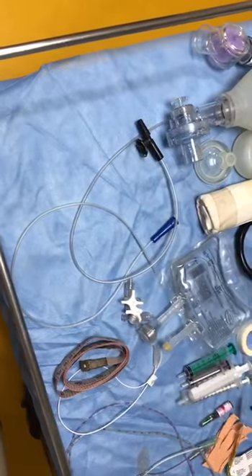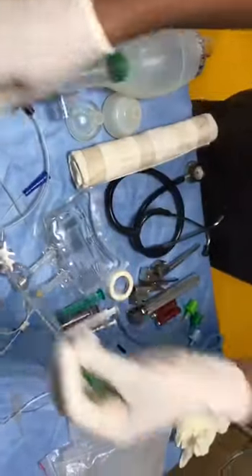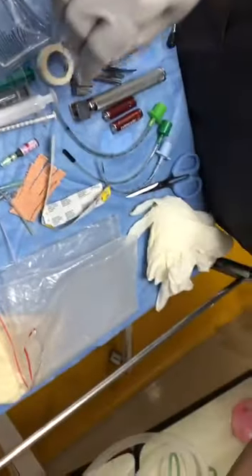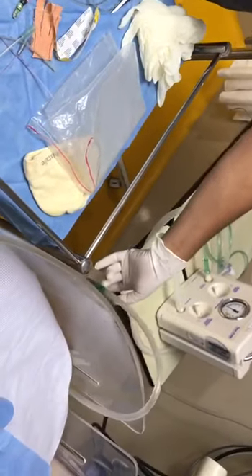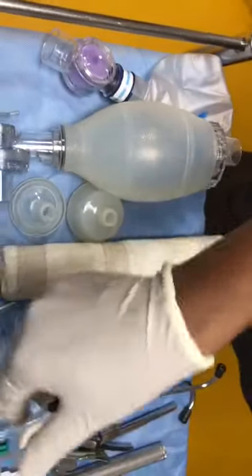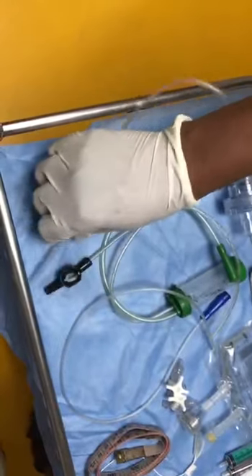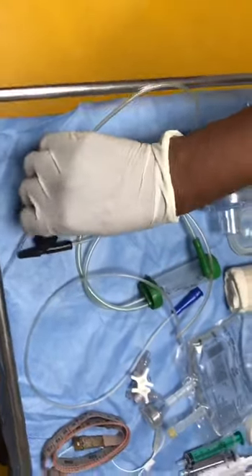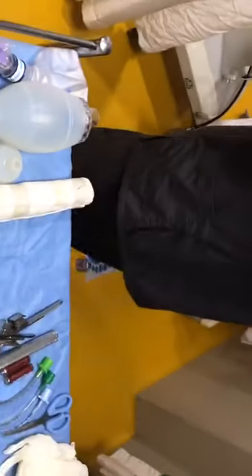I would like to have the pressure at 80 to 100 maximum, not more than that. I have a De Lee apparatus here for using it. Suction catheter is already connected. Suction catheter is there already, so I may use it if it is needed. Coming to the suction apparatus, the same. Meconium aspirator is there, if at all we need to use it. And for auscultation, I have a stethoscope, good quality, I hope.